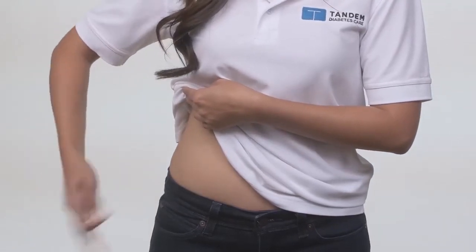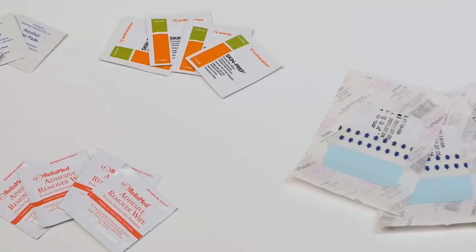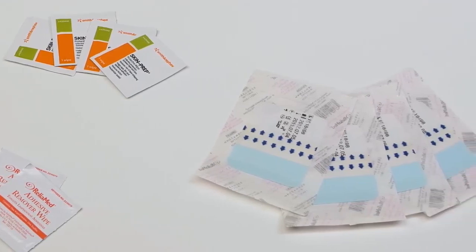This simple cleaning procedure can make a big difference, but if you're still having trouble keeping your site attached, there are some additional products you can try.